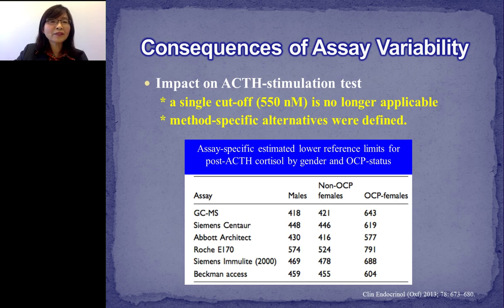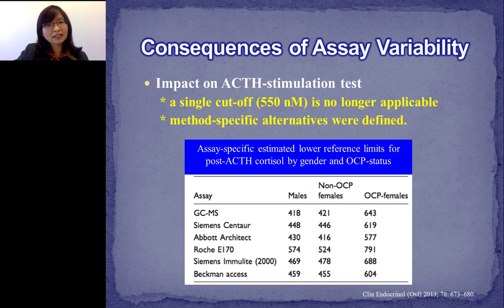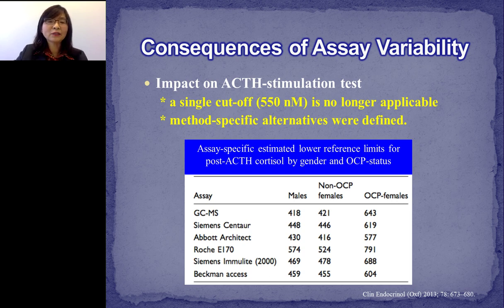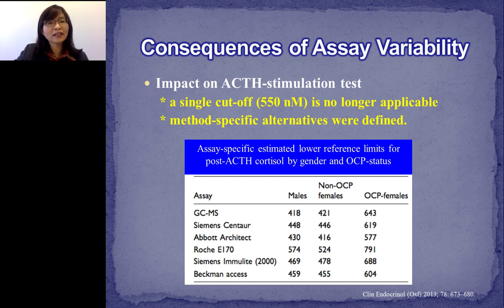A recent study revealed that cortisol assay variability has impacted the interpretation of ACTH stimulation tests used for differential diagnosis of adrenal insufficiency. A single cutoff value of 550 nanomolar, derived from historic studies, has been used for all clinical cortisol immunoassays when interpreting ACTH stimulation tests. However, in a recent study, cortisol responses after ACTH stimulation measured by five contemporary immunoassays showed apparent differences compared to GC-MS methods, especially in females taking oral contraceptives. Therefore, continued use of this single cutoff may lead to misdiagnosis of adrenal insufficiency and should be replaced by validated, assay-specific cutoffs.